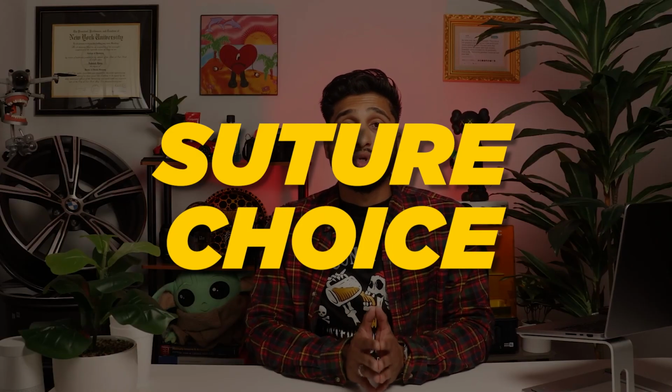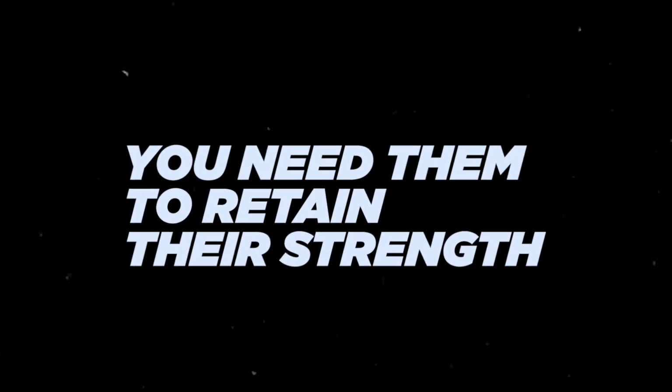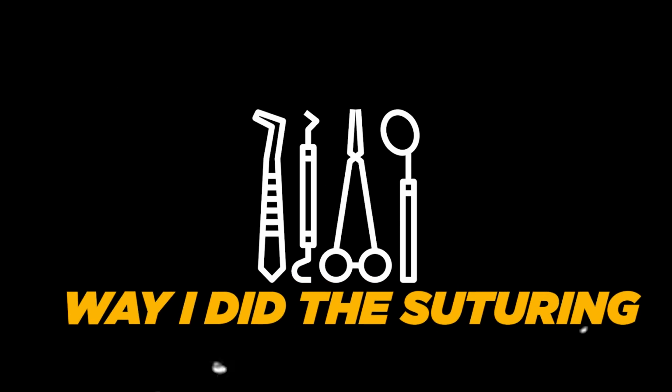Next, we talk about my suture choice. She says if you like to use PTFE sutures, use them. If you don't like them, use any other suture you do like that will keep its tensile strength for about a month. You're not gonna leave them in there for a month, but you need them to retain their strength. Next, she begins to comment on the way I did the suturing.